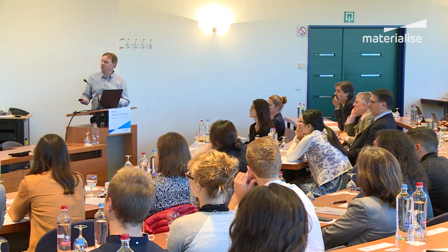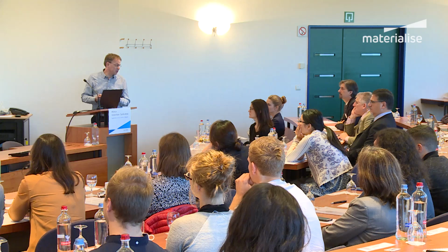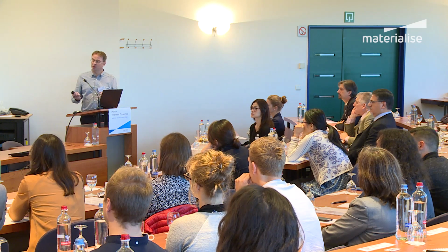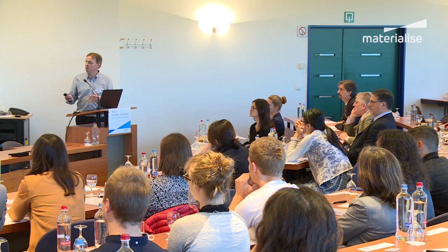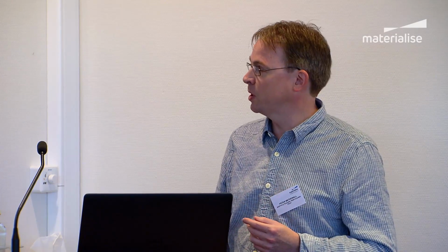And traditional ways of assessing the size was to do a two-dimensional measurement such as that. But that immediately raises questions, well, which slice do we measure? That's highly subjective. It's a highly irregular shape, so a two-dimensional measurement is probably meaningless. And we also get problems between follow-up scans with differences in patient positioning.